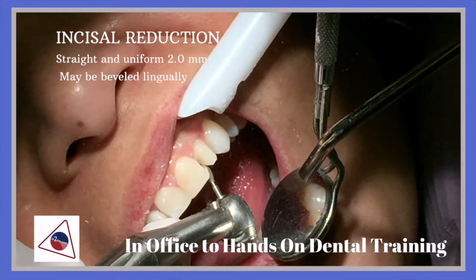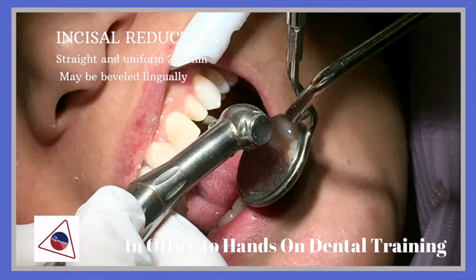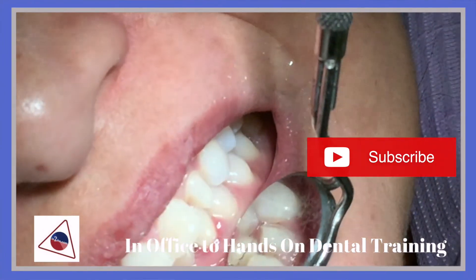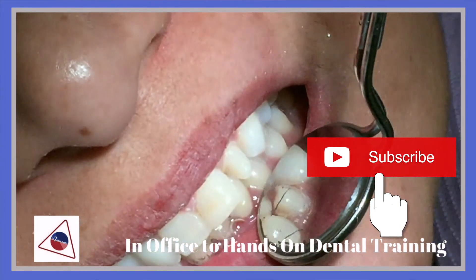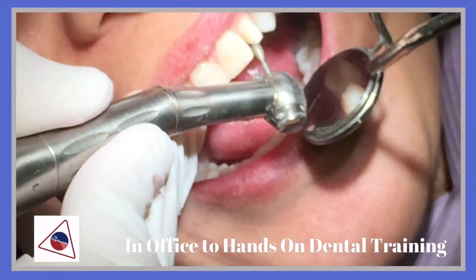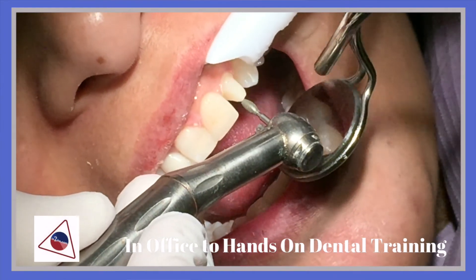Especially noting that the incisal reduction is straight and uniform — 2.0mm. Checking again the clearance on the lingual. And making sure that the lingual surface will be smooth and concave.